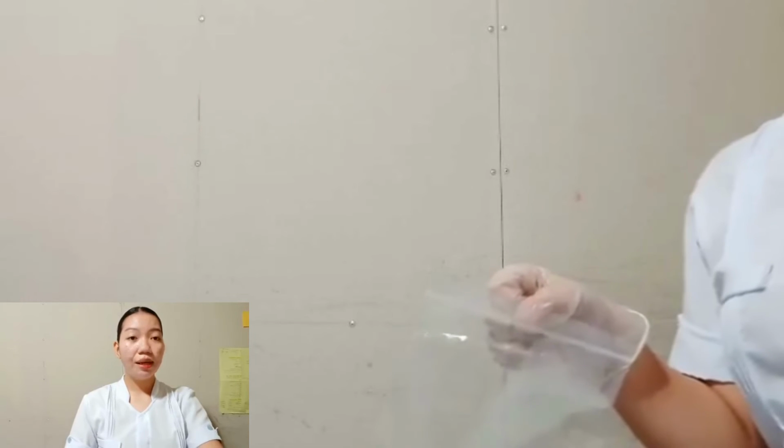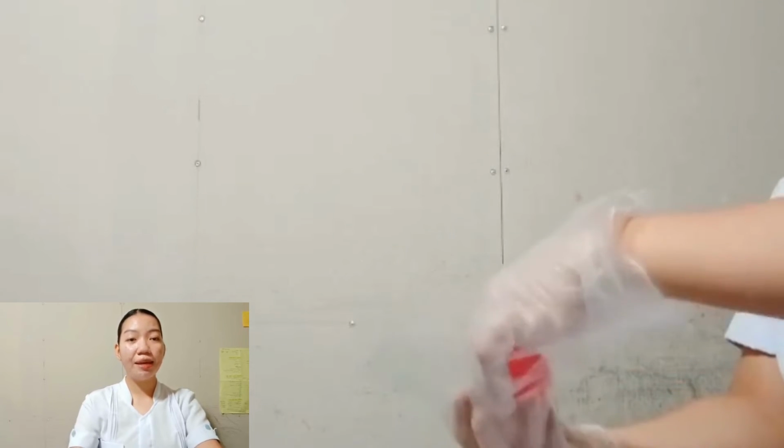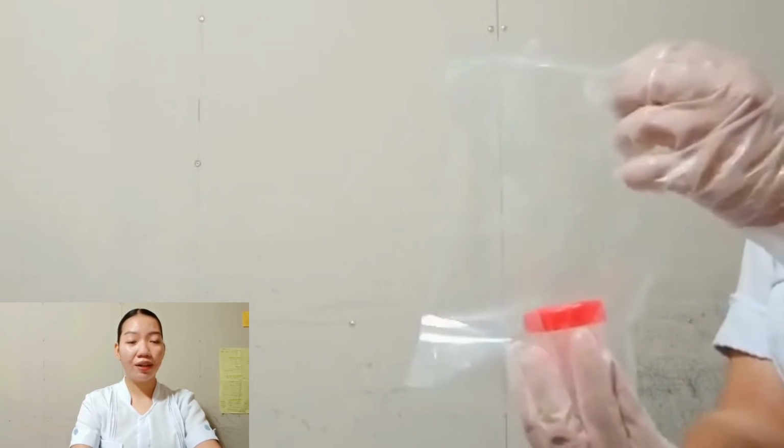Ask the client to cough up or expectorate the sputum into the specimen container. Make sure that the sputum does not contact the outside of the container. If the specimen container becomes contaminated, immediately wash it with disinfectant. Remove the equipment and return the client to a position of comfort. Remove goggles and gloves and then perform hand hygiene. Place labels on the container per facility policy, and then place the container in a plastic, sealable biohazard bag or the transport container. Remove other PPE if used and perform hand hygiene.